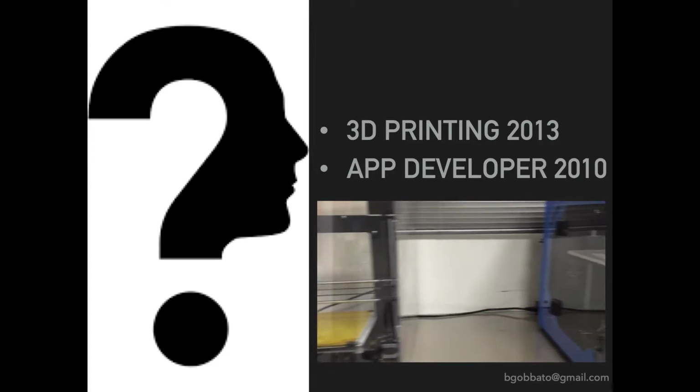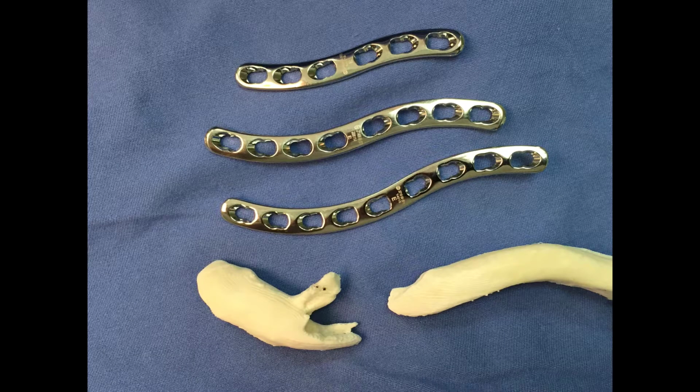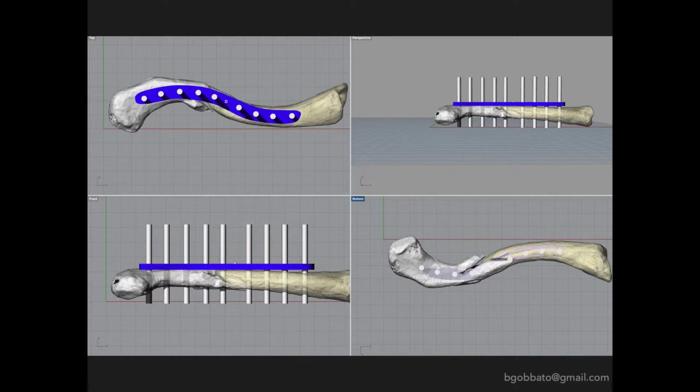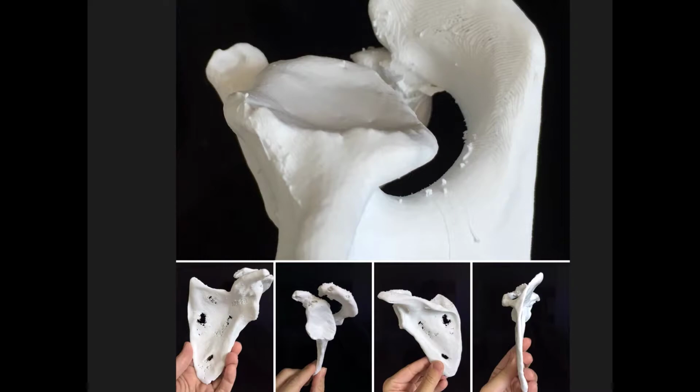We started using 3D printing in 2013. We have been developing apps since 2010. And we started our planning doing very simple things. For example, for a clavicle fracture, this is an old example of how we can use 3D printing to choose our implant or to do something like that. Then we moved to digital planning for clavicle fractures, actually for any surgery. And of course, we know that shoulder arthroplasty is one of the most important surgeries for us as surgeons to have a good planning.